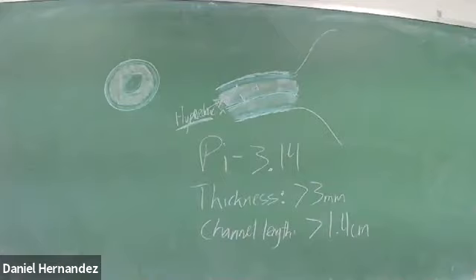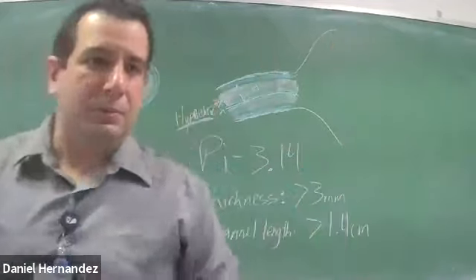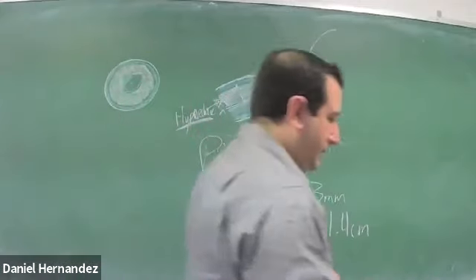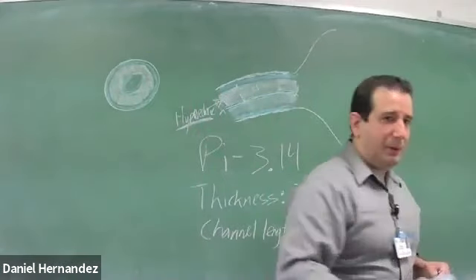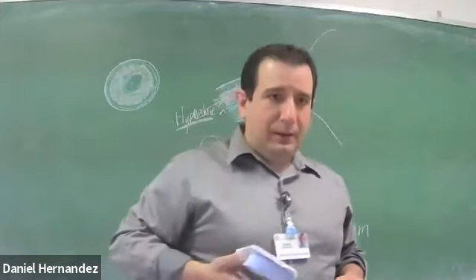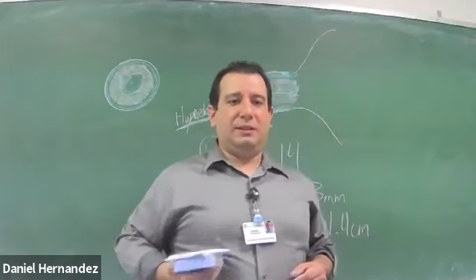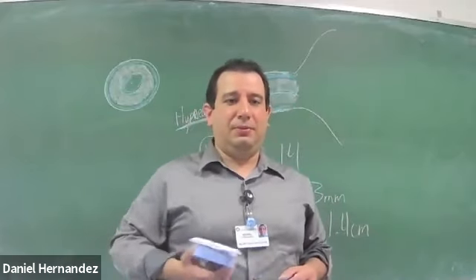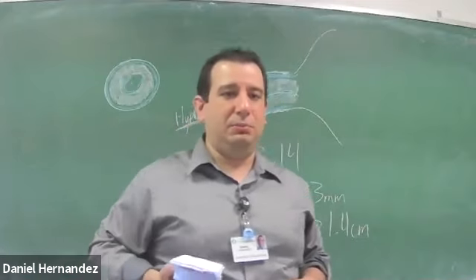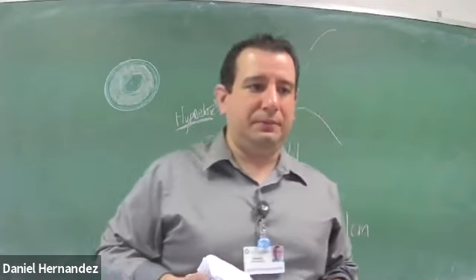I think what else. So for hypertrophic pyloric stenosis, my transducer orientation. So I'm typically going to be kind of in an oblique scanning plane. So I'm trying to visualize that pylorus muscle coming off here. So I'm in a transverse oblique plane, trying to get a long image of the pyloric channel.